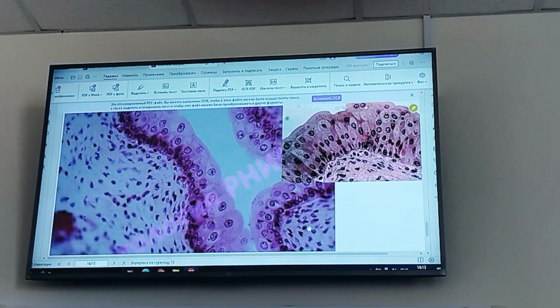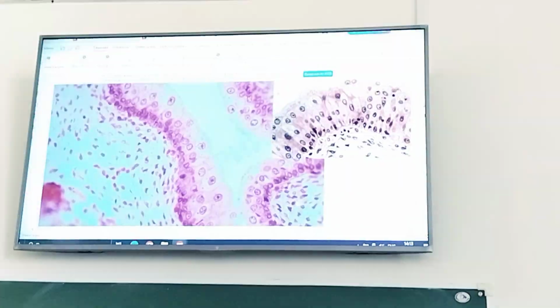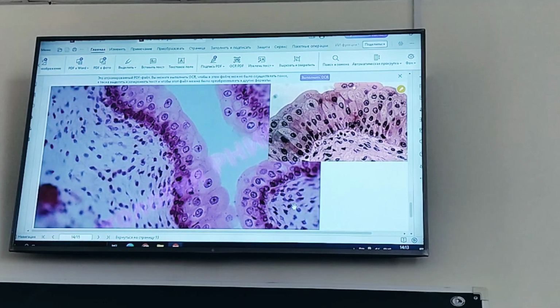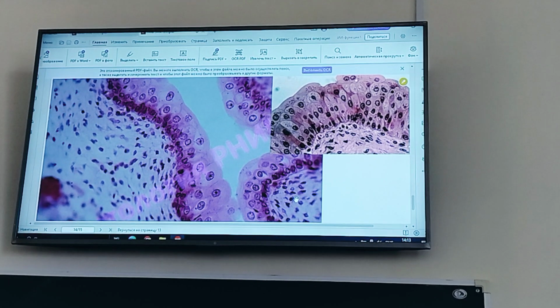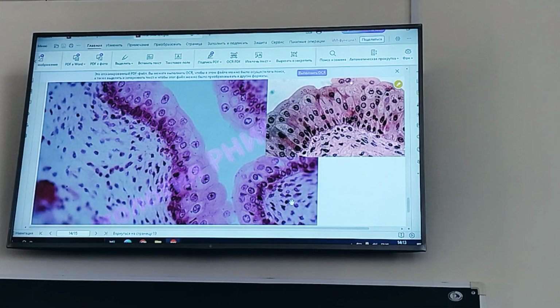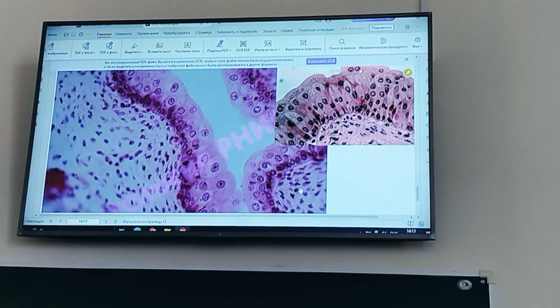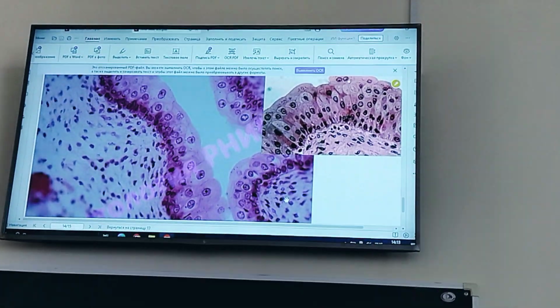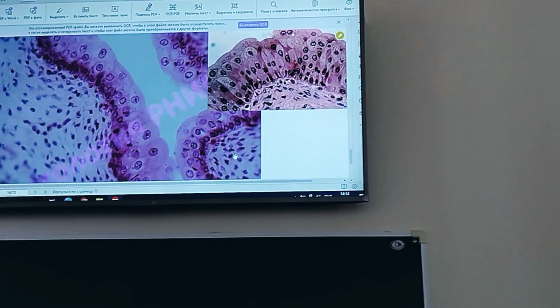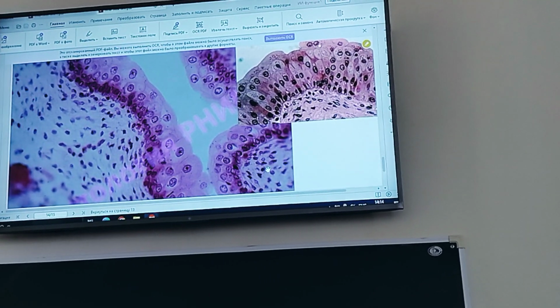You should also say this is a specific type of stratified epithelia, transitional. It would be perfect if you can explain what transition means: it has no constant shape, no constant number of layers. It transits between different shapes and layers depending on the stretching degree of an organ's distension, as in the urothelium of the urinary bladder. This will be enough.